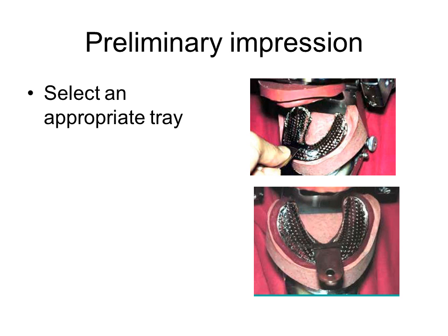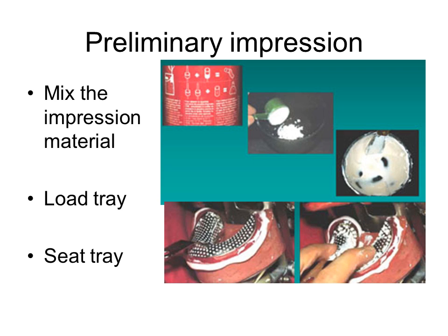Plastic trays should be coated with adhesive tack. Perforated or rim-lock trays do not require tack. You should strategically time your impression making so that undue delays in pouring may be avoided. Mix the alginate in accordance with the manufacturer's instructions. Seat the tray. Allow to set. Remove with one motion. Wrap in moist paper towel.